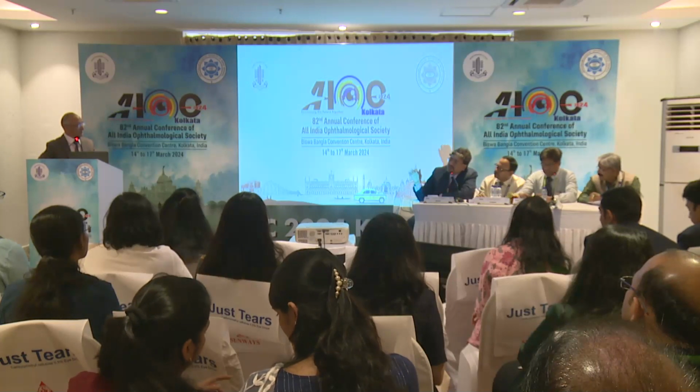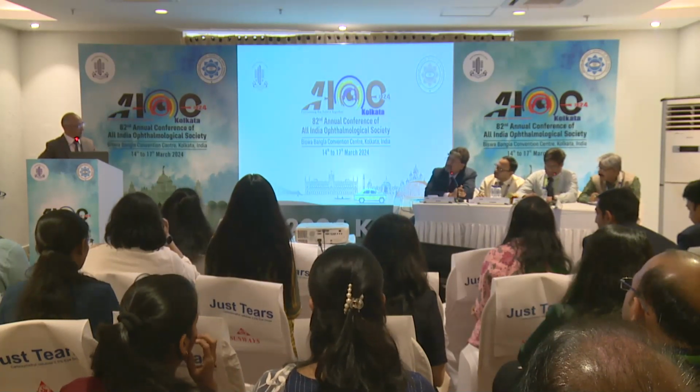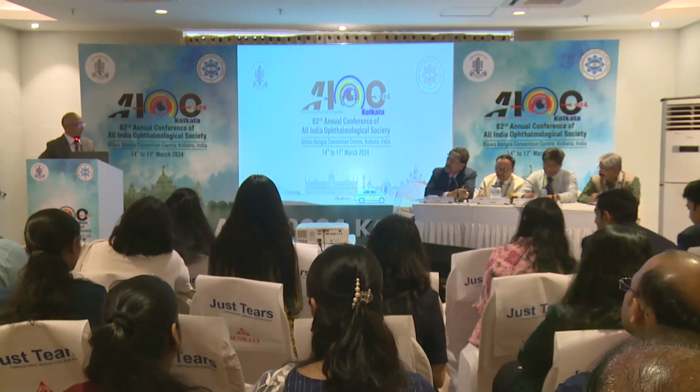So what viscoelastic would you prefer? Viscoat. This is a dispersive viscoelastic, which will not get mixed with the vitreous face. They move out of the posterior chamber slowly also later on.